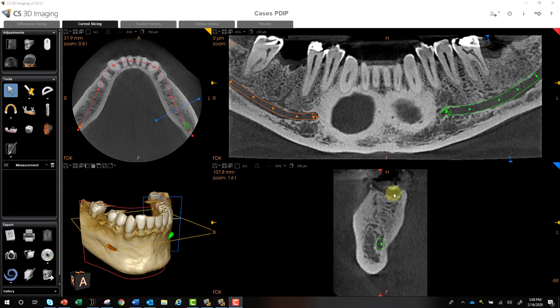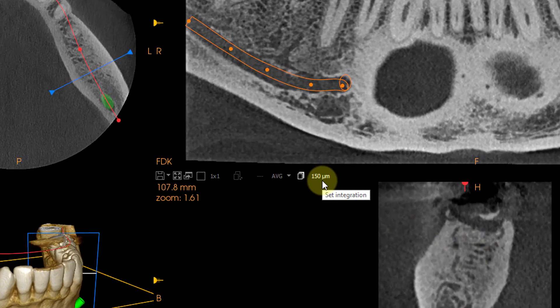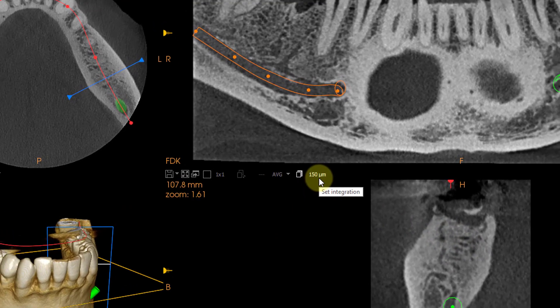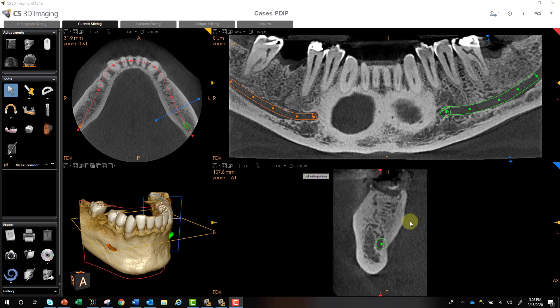One more thing to be conscious of: in your cross-sectional view this is a 150 micron slice — very, very thin, obviously much thinner than the width of an implant. So you have to be conscious of what's happening mesial and distal of where you are.